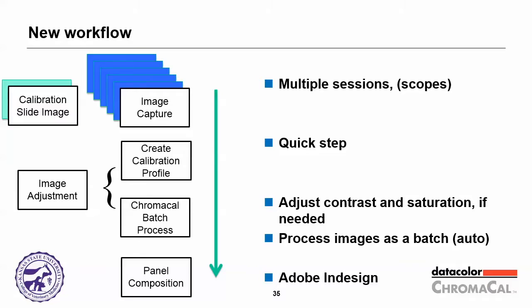And then once I have a set of adjustments, and sometimes there's zero adjustments, sometimes their software output is exactly what I want, I apply that to a given stain. So for all of my H&Es in the folder, or for all of my immunohistochemistries with DAB and Hematoxylin in that folder. And that's literally pressing the button, and I'm usually down the hall having a cup of coffee or on the phone or doing something entirely different. I haven't timed it, but several images will go through in a minute, so we can process very quickly, at least on the PC I have.